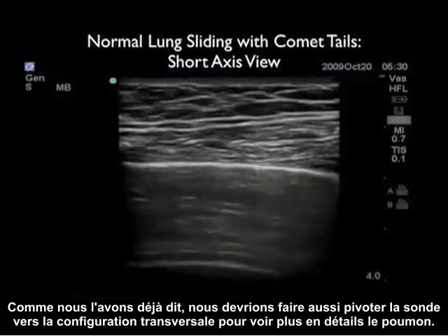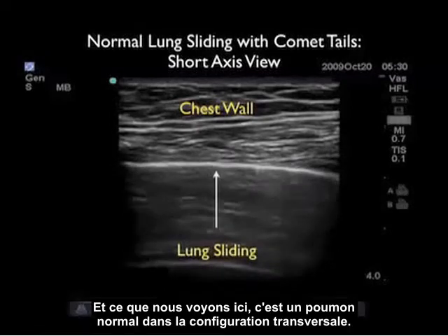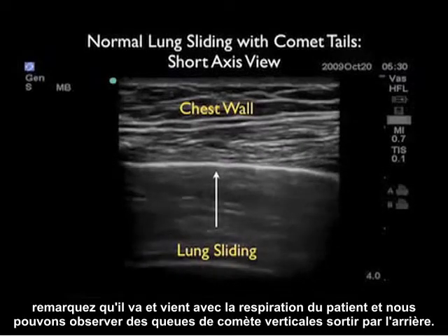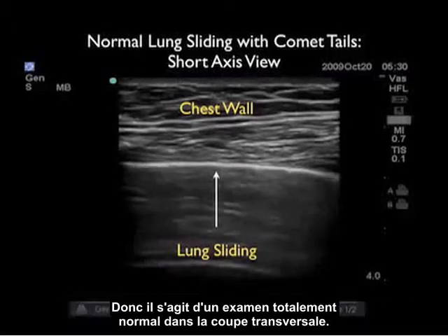We should also swivel the probe into the short axis configuration to further examine the lung. Here we have a normal lung in the short axis configuration. We're looking in between the ribs, so all we see is the dome of the lung. Notice that it slides back and forth as the patient breathes, and we see the vertical comet tails coming off the back — a completely normal examination in the short axis plane.